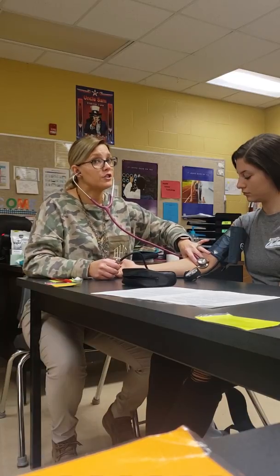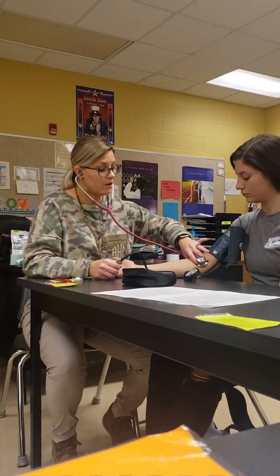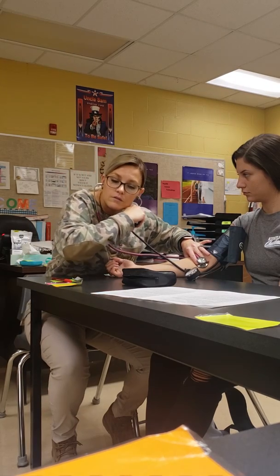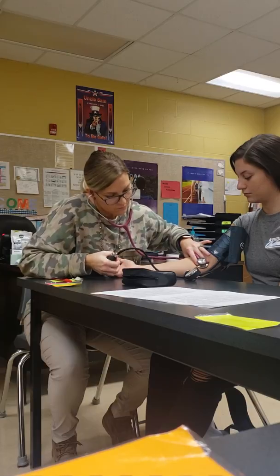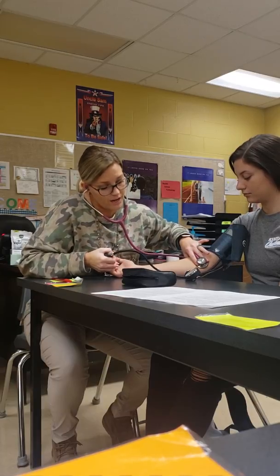So you have to push down with this. You see, I'm not just laying it on her arm, I'm pushing it down. You're normally going to pump up to about 180.